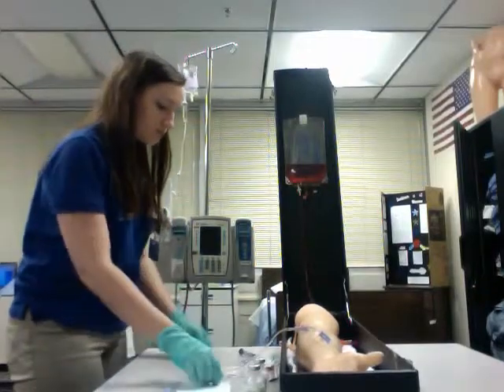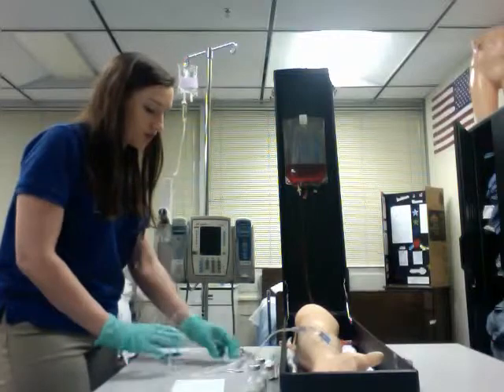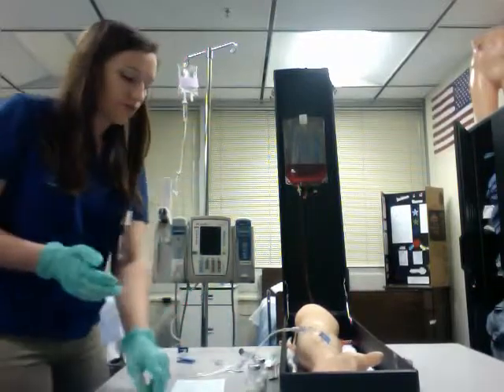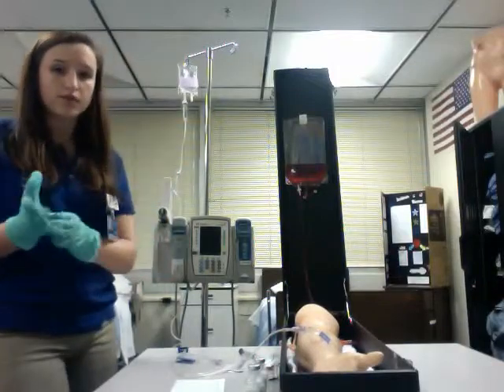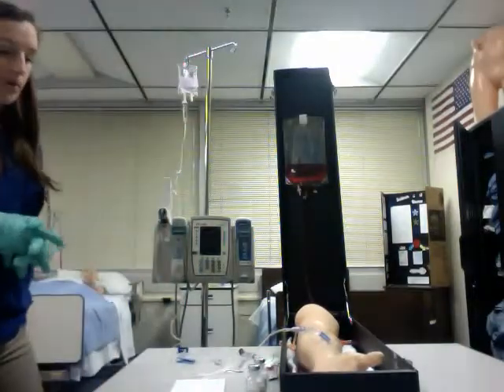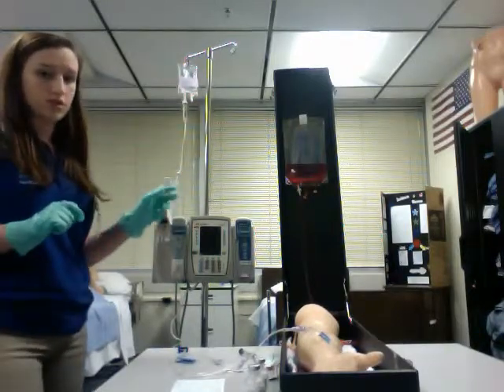It's good. So now I'm going to make sure that the patient doesn't complain of any pain or anything while it infuses. And after that's done, I'm going to go ahead and throw away all my stuff. I'm going to remove my gloves and leave the room. And then I'm going to come back in an hour just to make sure it worked and disconnect everything.